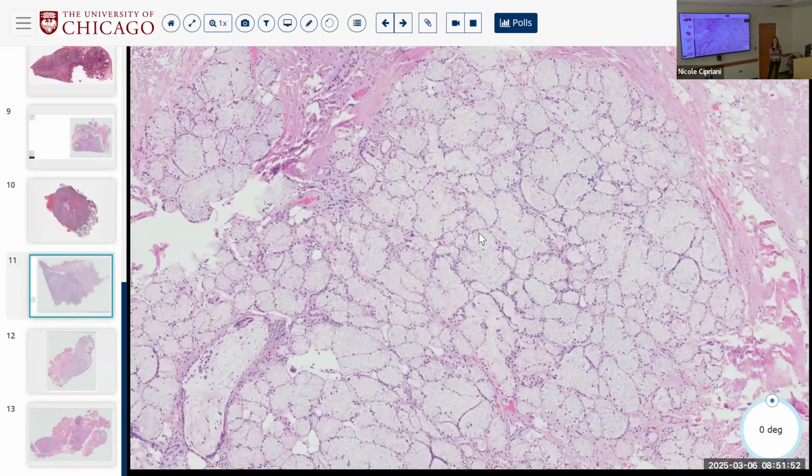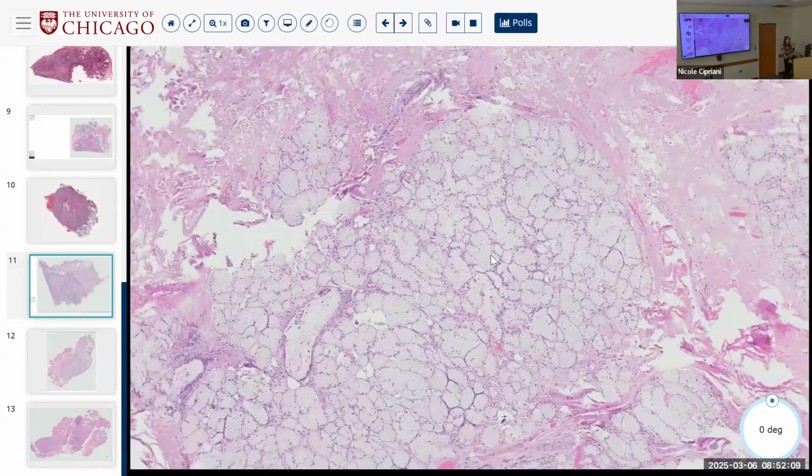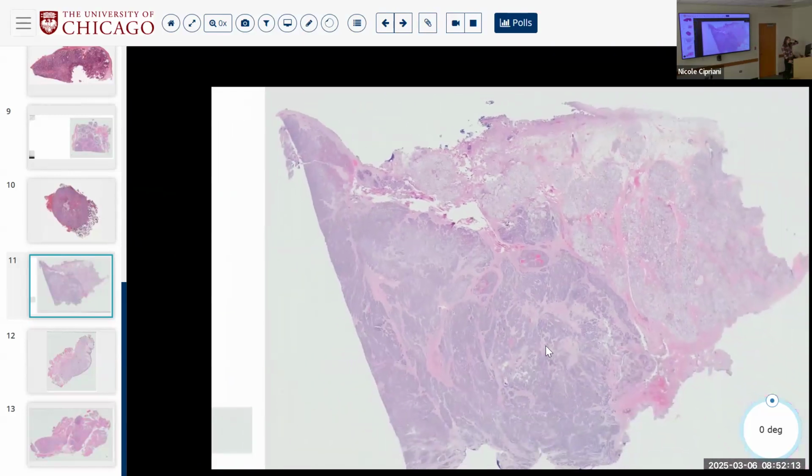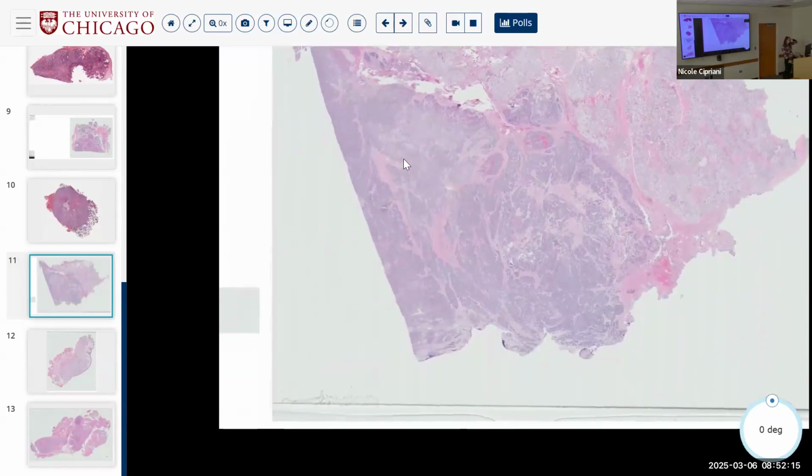Where else in the oral cavity has squamous mucosa and a predominance of mucinous? Palate, right? So think about the opposite side of the mouth, palate. Very common to palate is this picture of really mucinous-rich glands with an overlying squamous epithelium. All right, so we are probably in the palate.